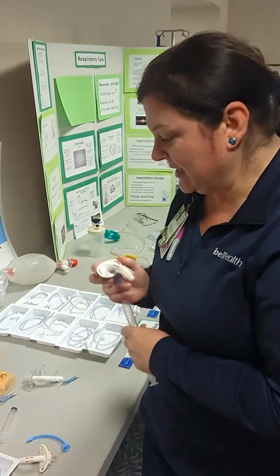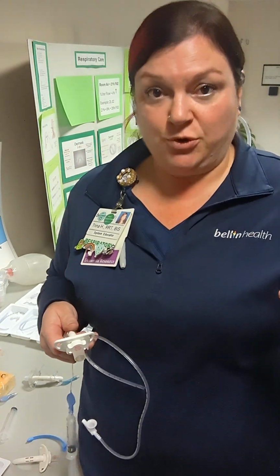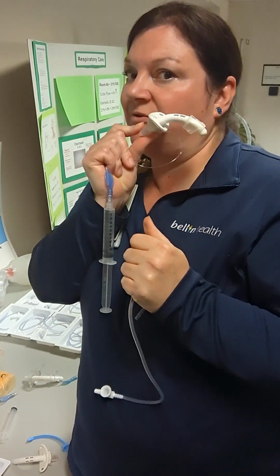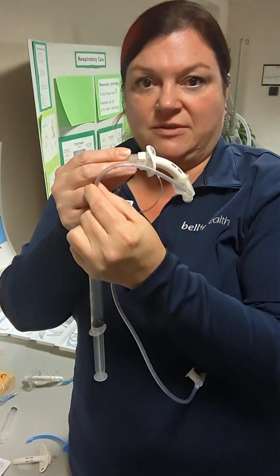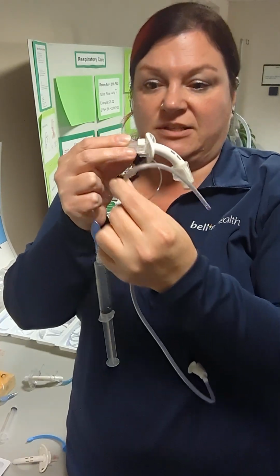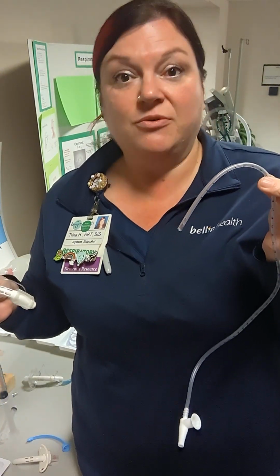Those are the differences. And when we're suctioning a trach, we do not need to use any kind of lubrication. No lube with a tube. And so typically the trach, you can kind of see how big it is. The amount of suction catheter we're going to use, we're not going to use this whole thing. We're only going to use as much as is going to be required to get to the underside of this airway. So chances are you are not going to go past lucky 13. I like to put my fingers at 13, so I just make sure I don't go past it.